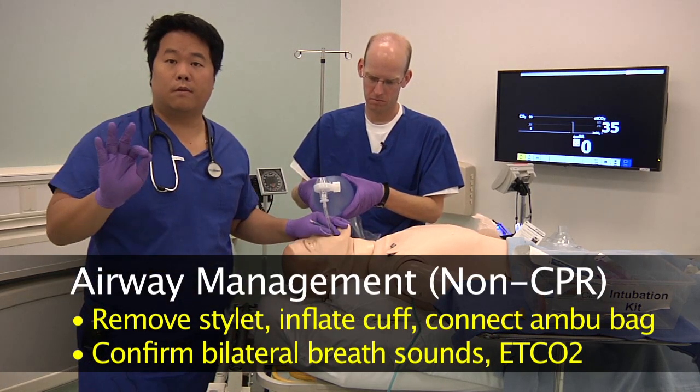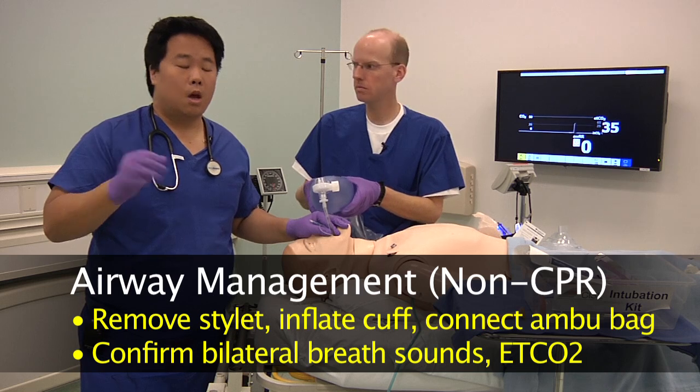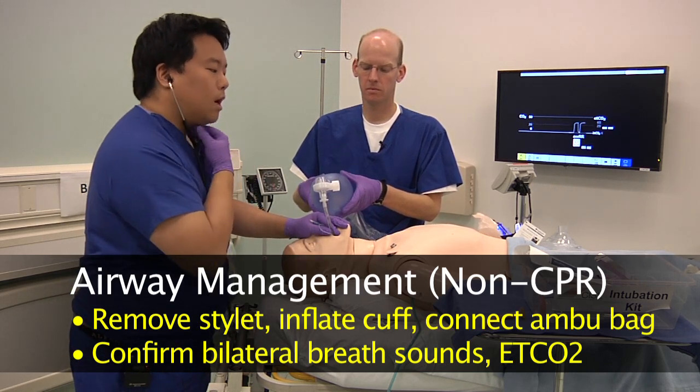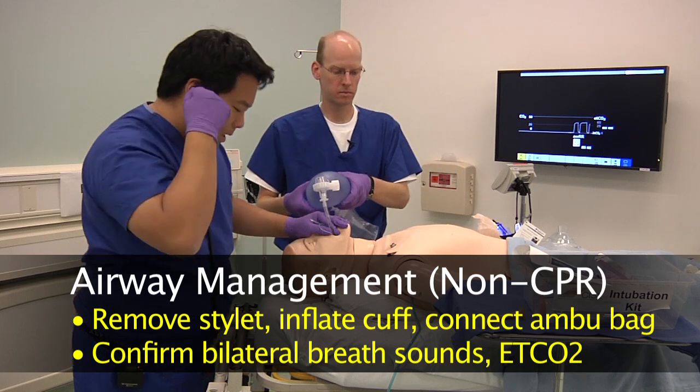Now, how do you confirm endotracheal intubation? What you can do is watch for chest rise. You can also auscultate the lungs to confirm bilateral breath sounds.